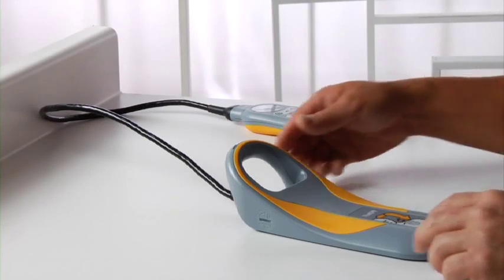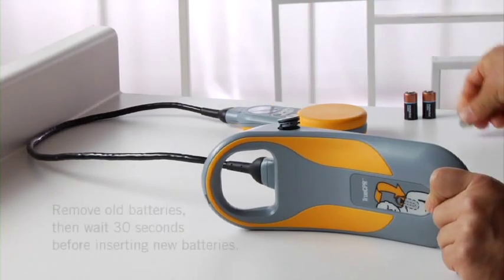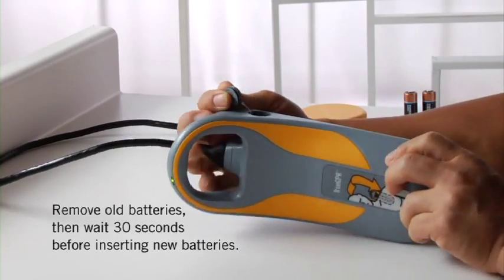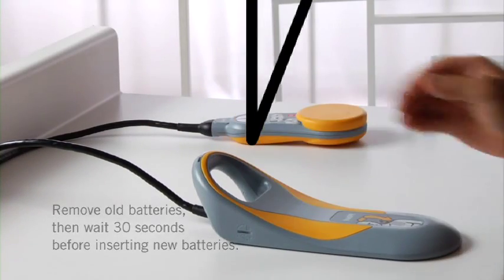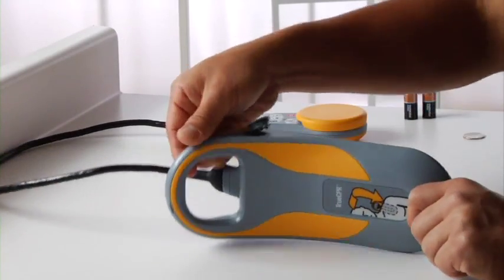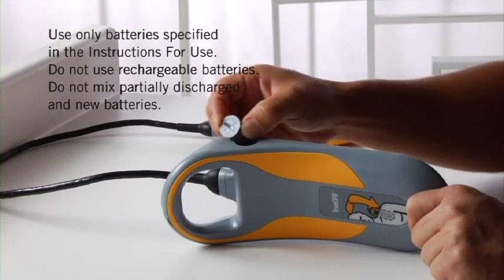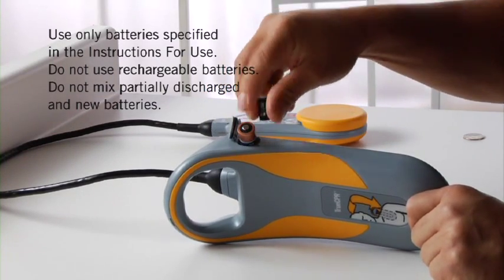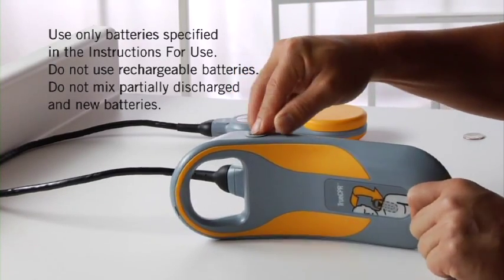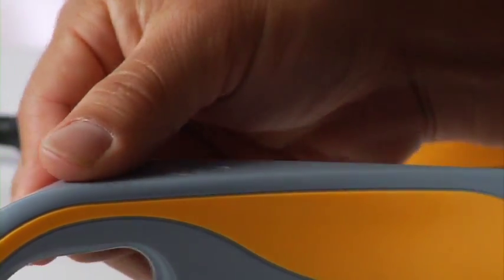To change the batteries, open the battery compartment and remove the old batteries. Wait 30 seconds, then insert the new batteries as shown on the compartment door. Close the compartment door securely and confirm that the light flashes.